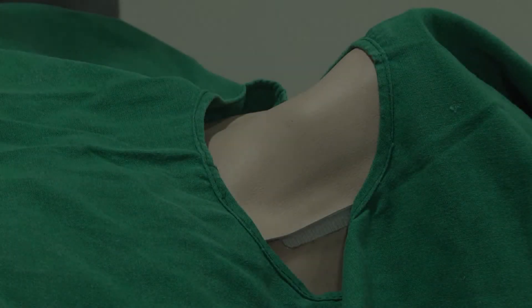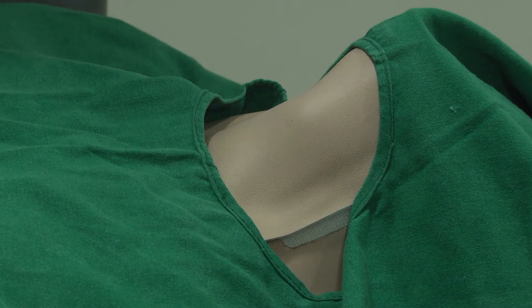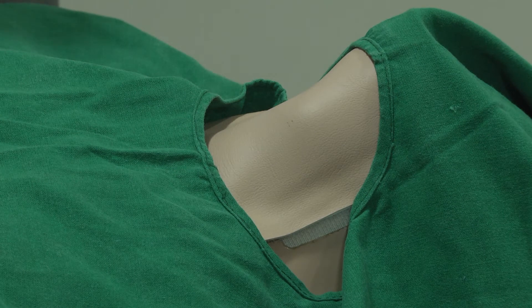Today we are going to demonstrate fine needle aspiration cytology of a thyroid nodule. After counselling the patient, a consent is obtained and the procedure is explained to the patient. It is performed on an outpatient basis. The patient is lying supine with a small pillow below the shoulder blades to give the neck slight extension.